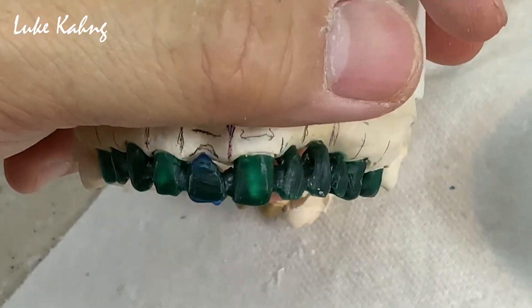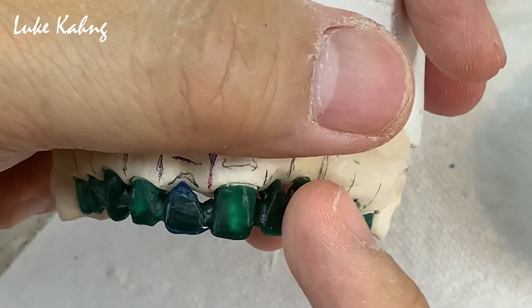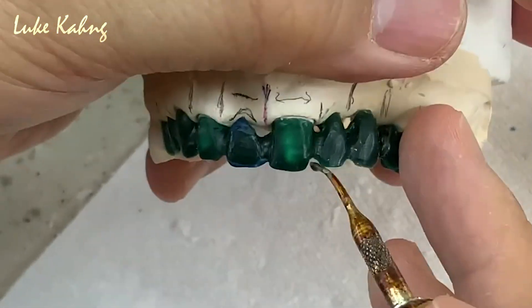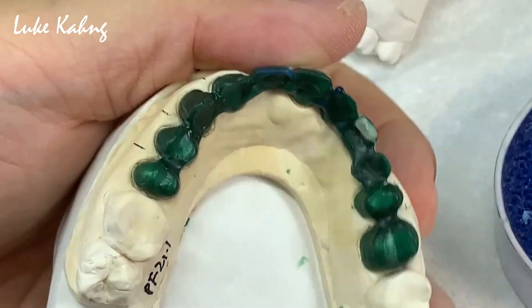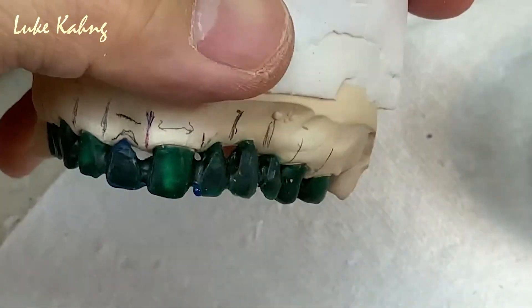When the patient smiles, I can get a nice six-unit smile design. I don't want to make it too long, I don't want to make it too short — because metal ceramic cracks easily. I have to add at the middle corner like this. Canines — I'm going to trim a little bit more.